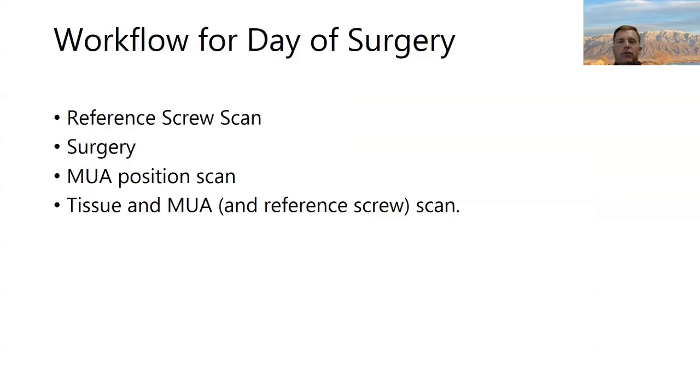So how do you do the day of surgery? What are the scans? I'll go through the surgical phase briefly, but I want to focus more on the scans. So the first thing, you're going to do a reference screw scan. You'll do surgery. We'll capture the MUA position, and then we'll get a tissue and MUA scan.